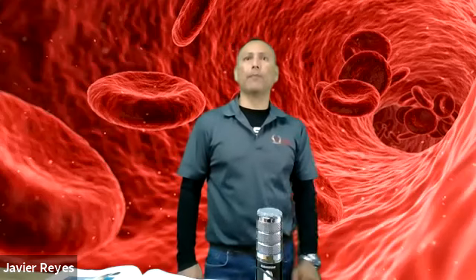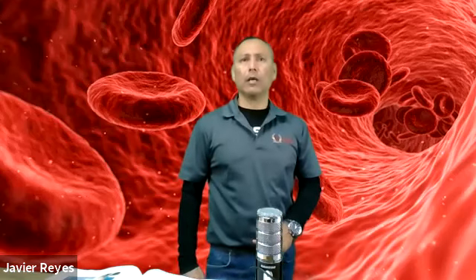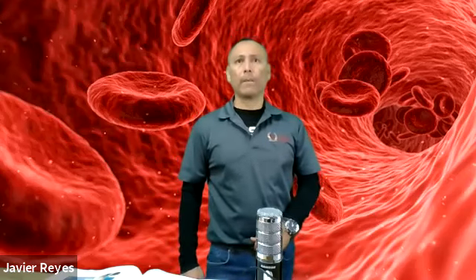Right. So remember that. Potassium levels may be falsely elevated if there's tissue fluid contamination or hemolysis of the specimen. What is hemolysis? The breakdown of red blood cells. So remember that term, hemolysis. Hemo is blood, lysis is breakdown.